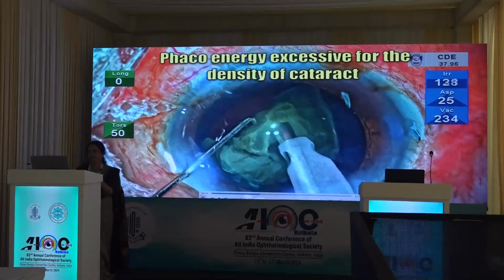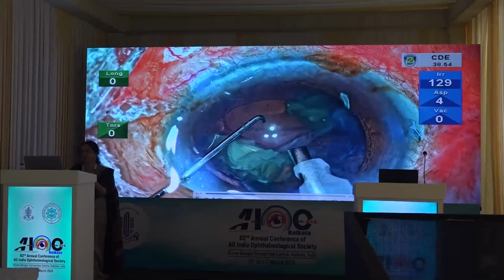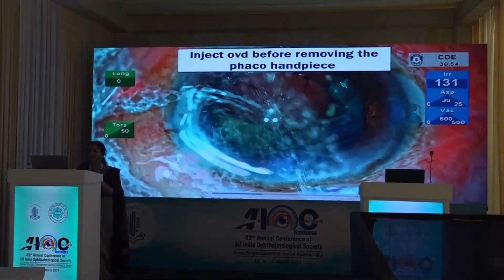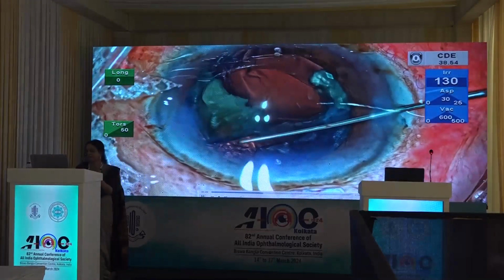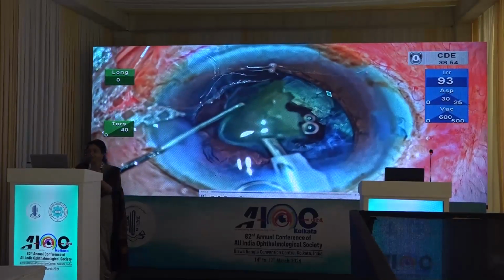When the penultimate fragment is being chewed, we can see suddenly there is a PC tear because the power delivered is excess, or maybe the chopper was at a deeper plane than usual. So here, the mistake was that the handpiece was removed before the OVD was injected. That is not to be done.